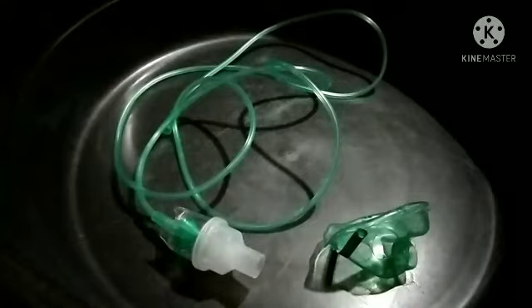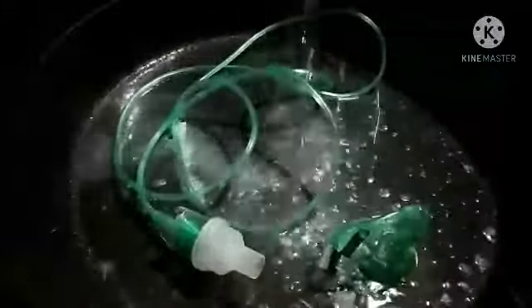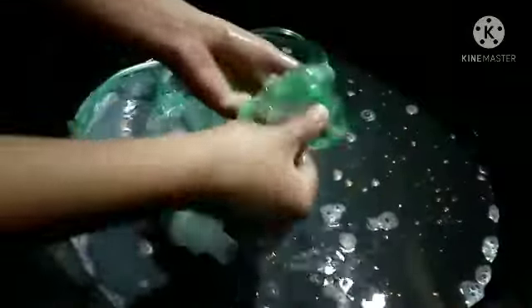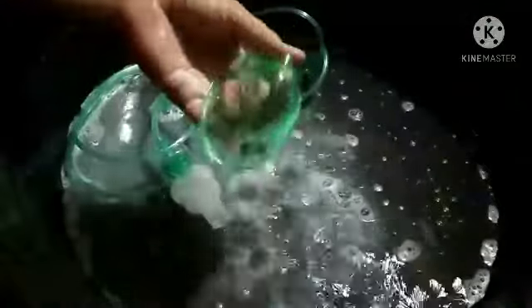Wash and dry the nebulizer, tubing and mask or mouthpiece with warm soapy water. Proper cleaning decreases the possibility of pathogens entering the client's respiratory tract. Retain the equipment in a polythene bag. For the patient's next administration, to prevent infection, the equipment should be changed every 24 hours.